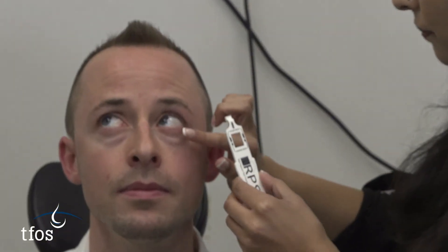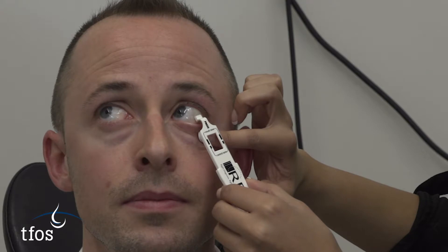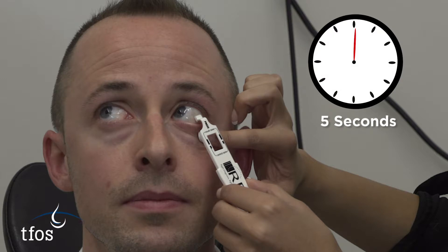The fleece portion of the test card is applied to the bulbar or palpebral conjunctiva and soaked with tear fluid, with a minimum of six to eight dabs across multiple locations, holding in place for about five seconds until the fleece glistens.